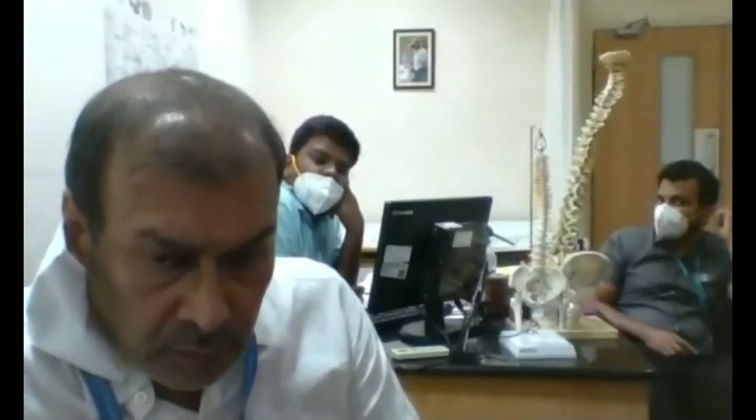If you have to give a message to those who are participating, I would say that this is the miracle tool, and I am sure everyone is going to use it more and more, and we have been seeing a lot more indications coming as well. We use this tool for the laminectomy when we do intradural tumors as well. We lift the whole lamina and then we put it back afterward. Then we suture it. And we have found zero CSF leak when we do this procedure. And probably we have preserved the anatomy. So if somebody has a recurrent tumor, then we can go back again. That is what we have been practicing for the last few years.